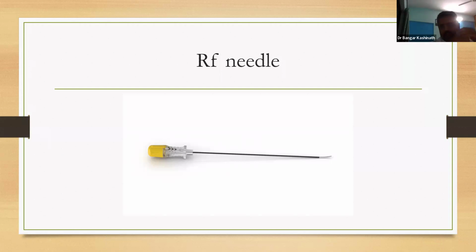Everything is written on that particular instrument. If it is an RF cannula or a spinal needle, it is written there how it is pre-sterilized. So here you have to talk about the tip, straight, curved, various sizes of the needle and the sizes of the uninsulated part of the tip. Correct? Various indications. What are the various indications?